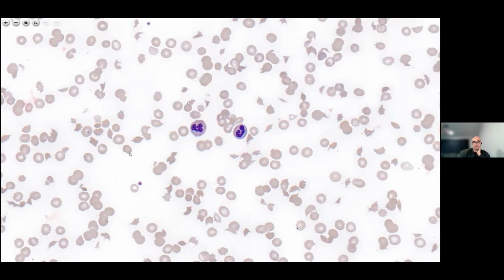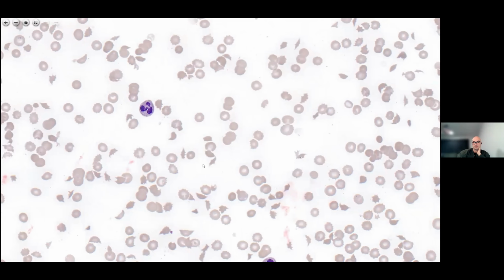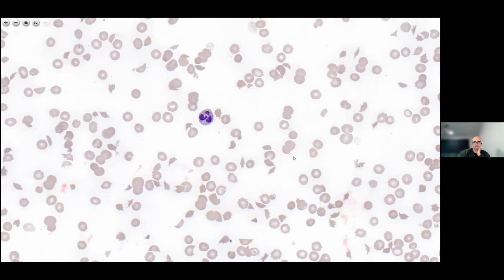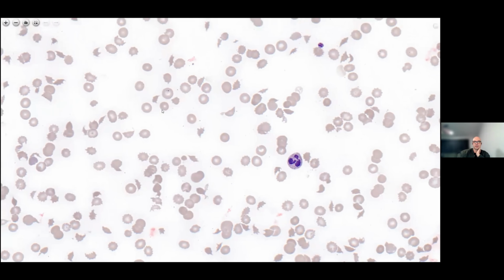No, I don't. I think, just answering some more comments on the comment section, on the significance of the percentage, I think 1% of all red cells is generally significant. Yep. And in cases that I've seen, this is very, very obvious, but in some cases it can be quite subtle as well. There was a move previously to monitor the percentage of schistocytes with treatment, but now that's been superseded by other techniques in patients with TTP.